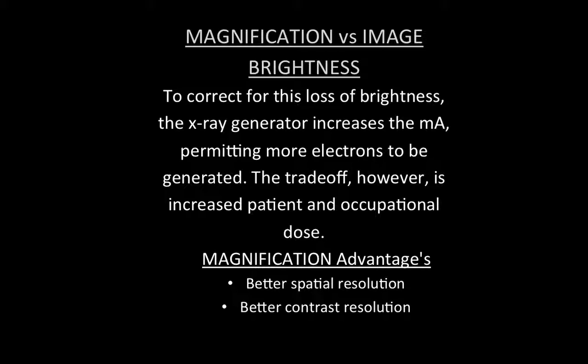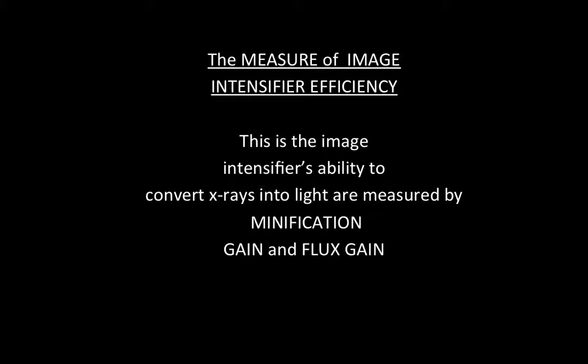Magnification versus image brightness. To correct for loss of brightness, the X-ray generator increases mA, permitting more electrons to be generated. The trade-off, however, is increased patient and occupational dose. Magnification advantages are better spatial resolution and better contrast resolution.